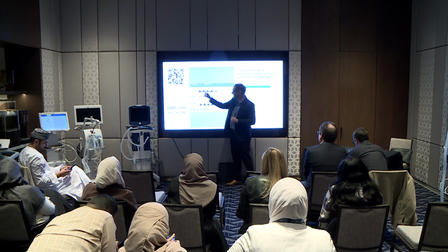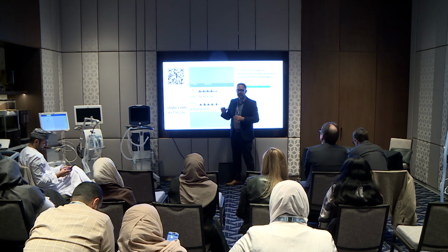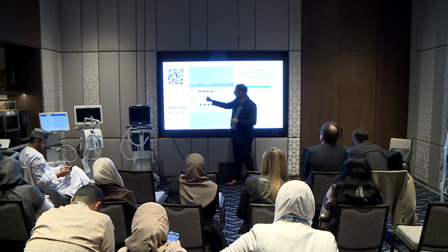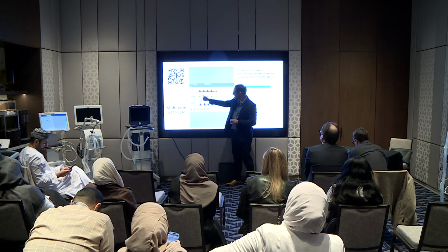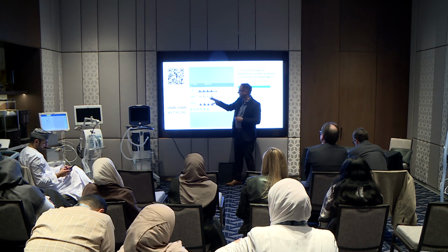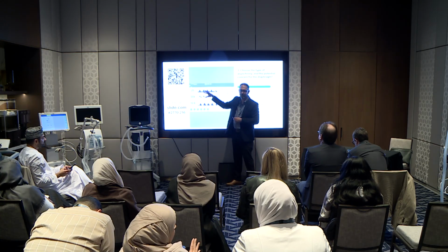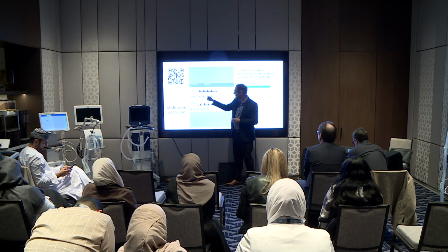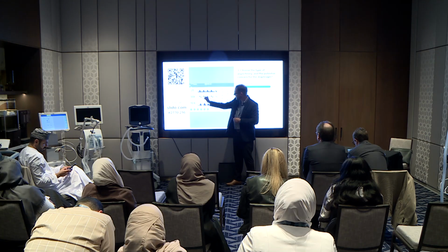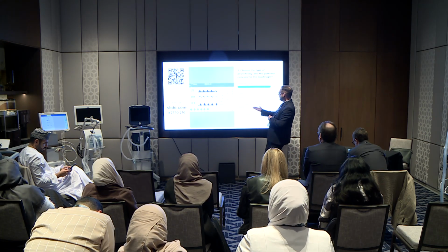So there's no trigger, so right away it tells you that any patient activity after triggering is going to be reverse triggering. In this case, the flow starts to decelerate when the breath is delivered, as it should, and then it goes back up because the patient is now inspiring. Remember, I can see little things in pressure, but this is less likely to tell me what I want to know because it's pressure controlled. There's the flow, goes back up, and when it cycles off, there's this little blip, which is the post-inspiratory loading.